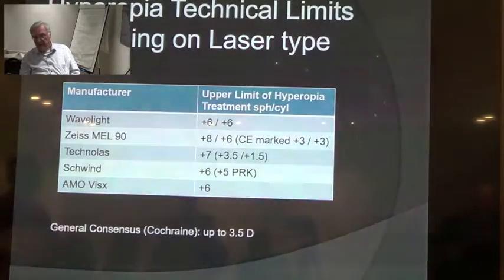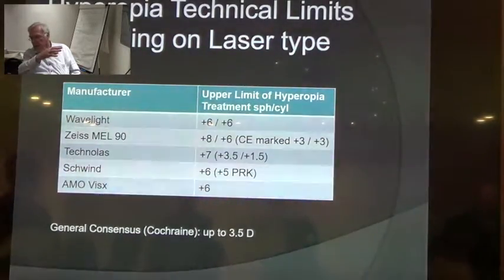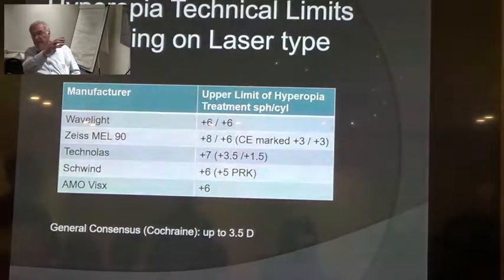The limit, you cannot go further than 48 or 47, because then the cornea is bent so much. Yeah, 49 is already a lot. They don't say the K value and the corneal diopter. They only say this is the hyperopic range we can do.